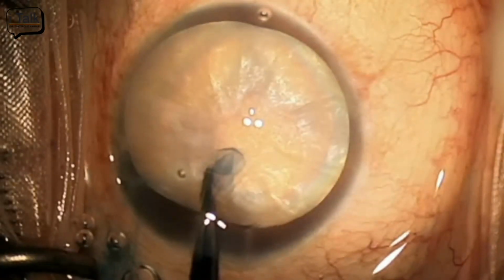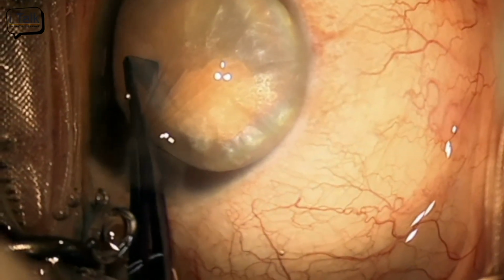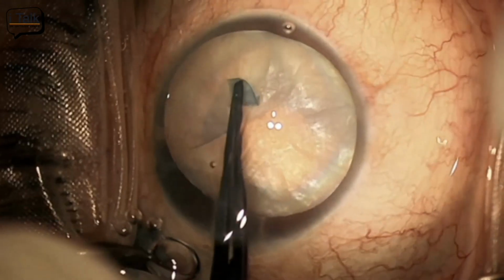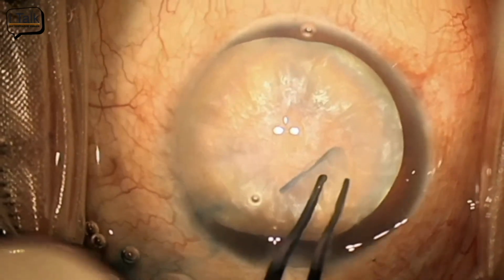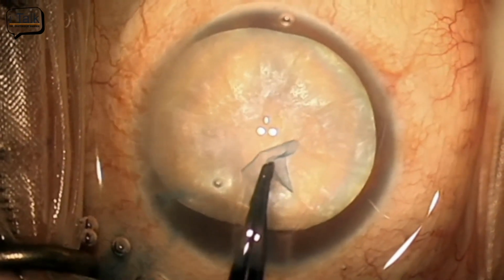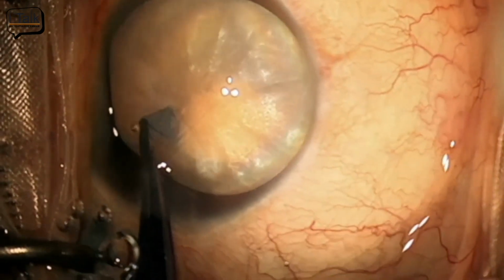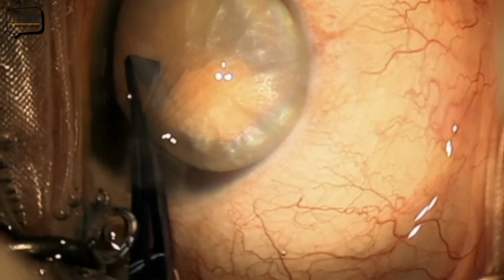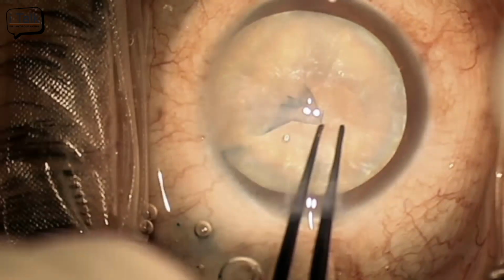This is another situation where it did not run at first; we did a small one. This is one of the surgeries that you had sent. What do you think went wrong here, and how could it have been prevented? Let me play it one more time. Two-thirds went very well, but when it was nearly at the end of the capsulorhexis, it just went to the periphery.